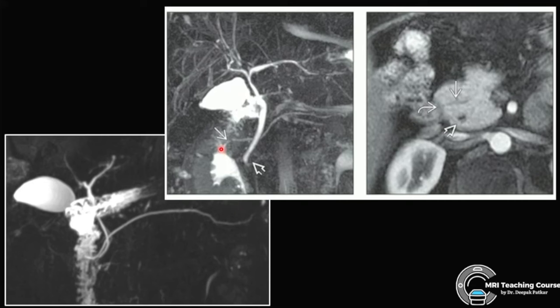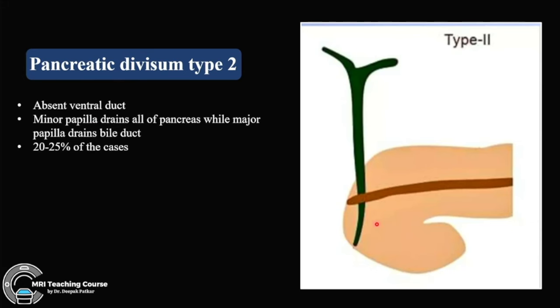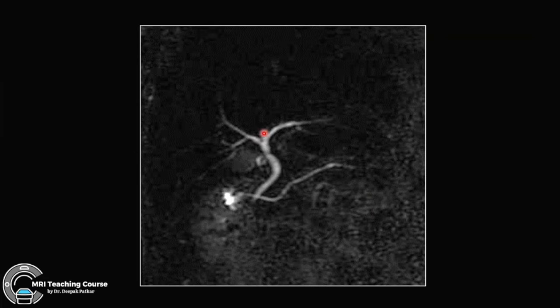These are examples where you can see the minor papilla and the duct of Santorini (minor duct), and a thin line representing the major duct — there is no communication at all. On cross-sectional images, just look through the pancreas and see whether it is draining into the minor papilla. Pancreatic divisum type 2 has an absent ventral duct, seen in 20 to 25 percent of cases; the minor papilla drains all of the pancreas while the major papilla drains only the bile duct.